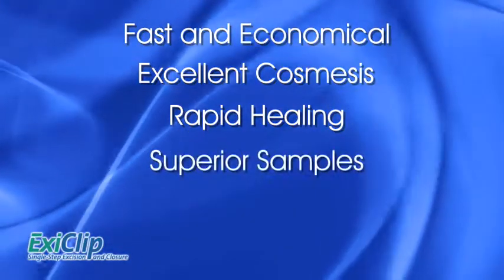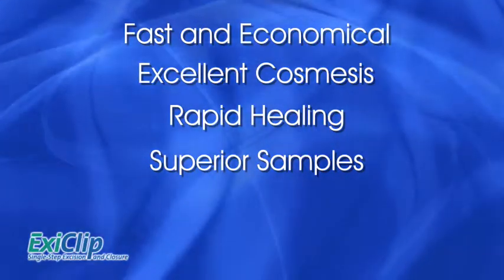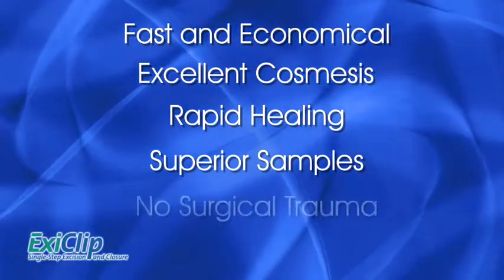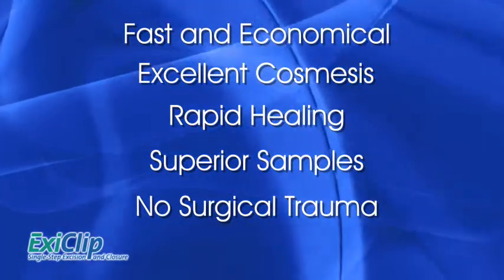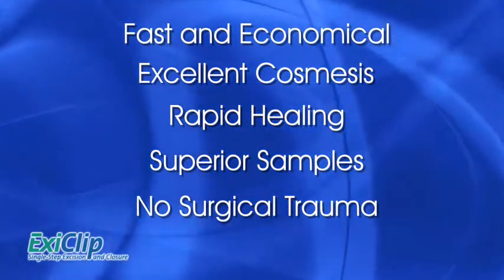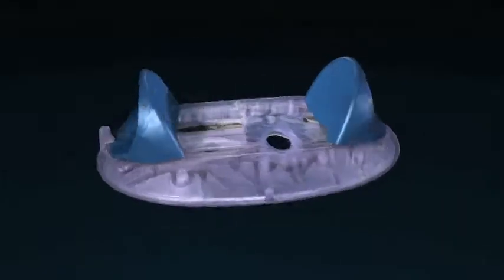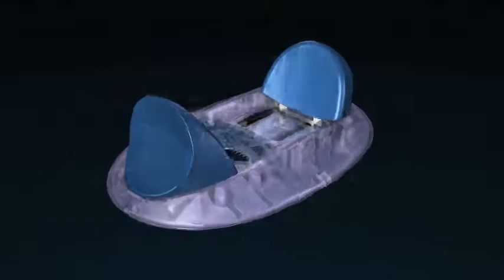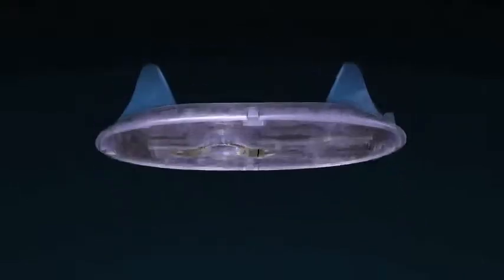The ExeClip provides consistent, reliable, superior tissue samples as preferred by pathology. The small, streamlined ExeClip completes the procedure with little or no bleeding, appealing to patients prone to surgical anxiety. The ExeClip offers significant benefits and advantages for skin lesion removal and biopsy samples for both the patient and the practitioner.